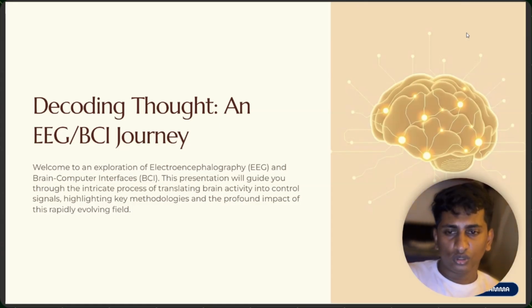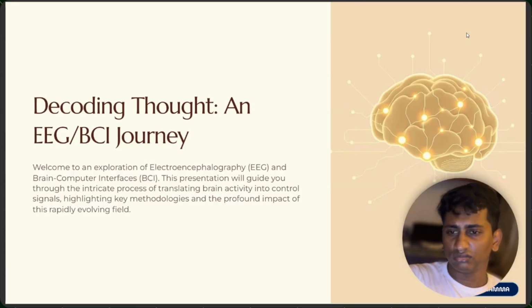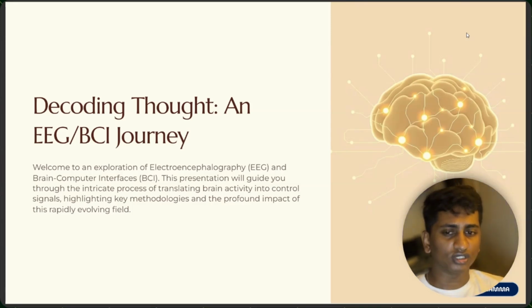It can be used. For the future scope, you can do online transfer learning to adapt across cross-subject variability. Let's say there is one subject in India and another who is an expert in EEG or brain analysis for some disease elsewhere; they can easily be mismatched. You can also combine EEG and EMG, and use hardware acceleration for sub-second latency in real-time BCI. So that's it for today, and I'll take questions.